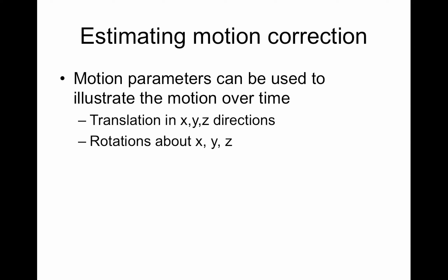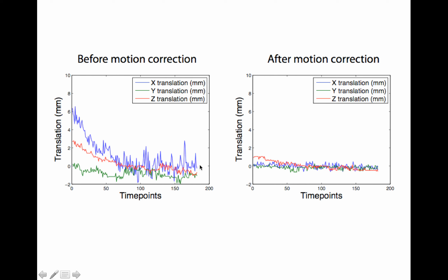The motion parameters can then be used to illustrate the motion — we've already looked at this through the framewise displacement (FD) metric, which uses these. We have translations in millimeters on the left and rotations on the right. These are the translations before and after motion correction. You should never run motion correction more than once — running it more than once causes it to start fitting to the signal in the data and you can remove your signal. I never worry about big drifty things; I worry more if there's a big spike, and this one doesn't have any.